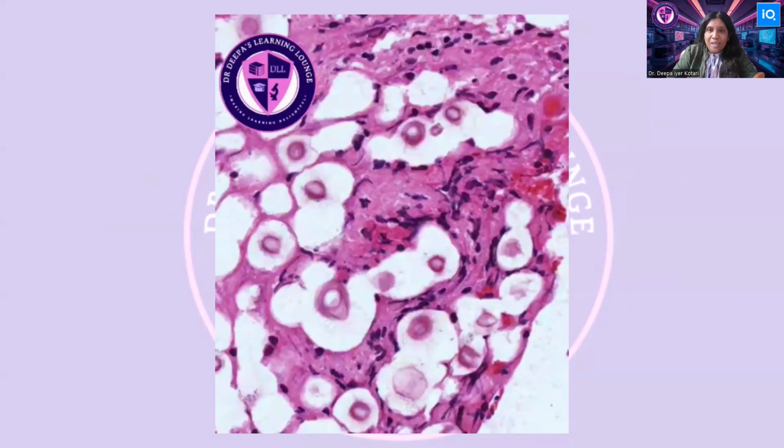One differential is the spores of Candida. If you just see the spores of Candida and you don't see any hyphae, then those spores also can look a bit like Cryptococcus, but that halo will not be there. The thick capsule will not be there. If you find pseudohyphae, then you are really sure that it is Candida. Unlike Cryptococcus, Candida does not produce the thick wall, and so the mucicarmine stain will definitely be negative. Both PAS and GMS stains are positive in both organisms, so they are of no use to differentiate.